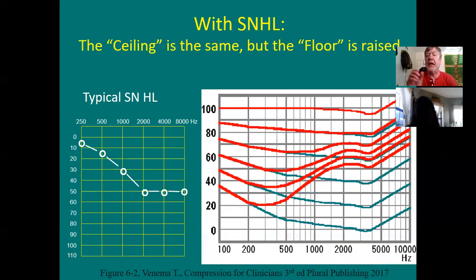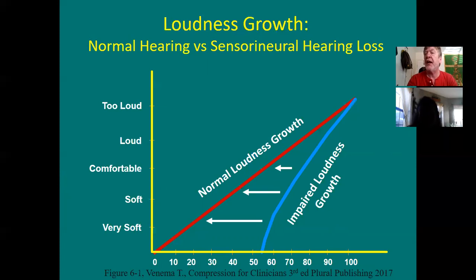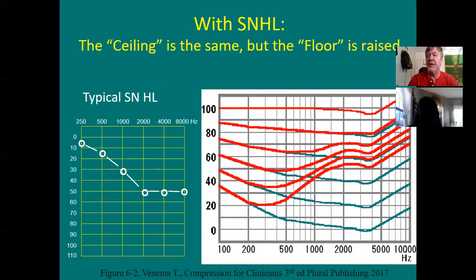This is a way of looking at the same slide as this, okay, only now we're adding frequency to it. So here's a hearing loss sloping down on the left, your typical Joe Blow presbycusis. And now look at the right-hand picture. See the bottom blue curve? That's minimal audible pressure. That's the softest it takes to hear all the different frequencies with one ear under a headphone.